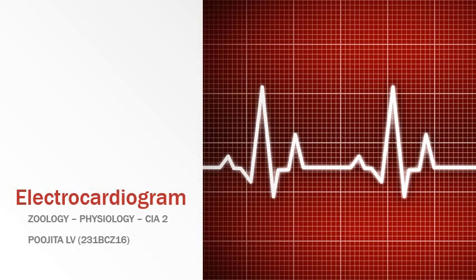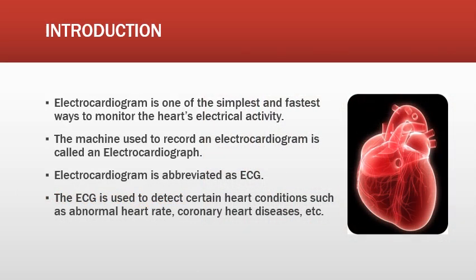Okay, so my topic is electrocardiogram. Electrocardiogram is one of the simplest and fastest ways to monitor the heart's electrical activity.